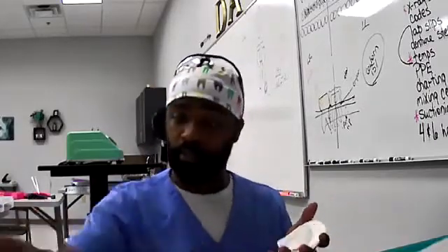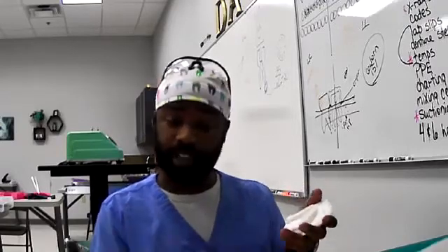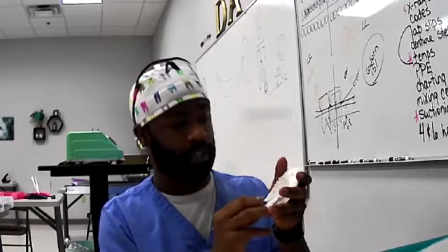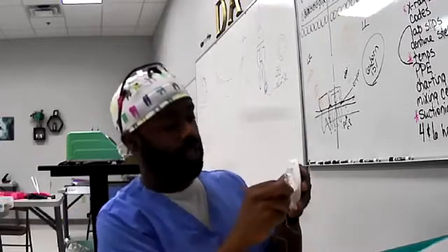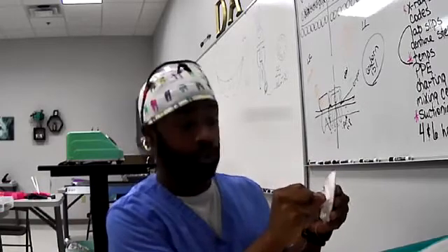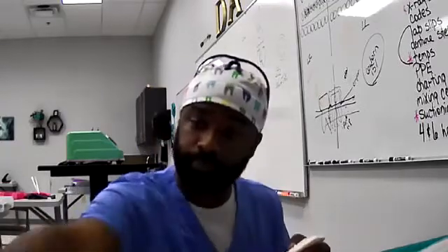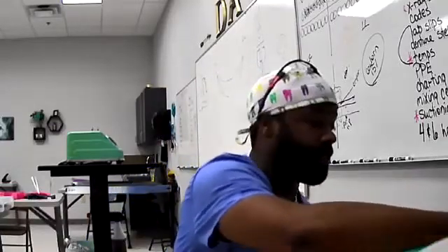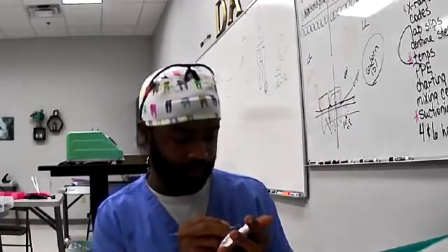You check your bite again with articulating paper: bite, tap, tap, tap, grind, grind, grind. Once they finish that, if there's anything left over, you get your scaler. Make sure everything's clean really well. You get your floss, go back in there, and floss everything. Make sure the floss goes all the way down to the contact. That way you know whenever that patient leaves, they can still floss, because if they can't floss, it's going to be a problem. After that, that's it. Same thing, just a couple more steps with the composite. I'm going to take those out for class tomorrow, though.